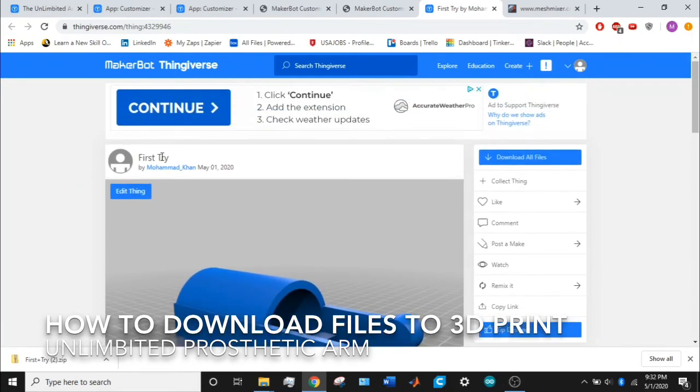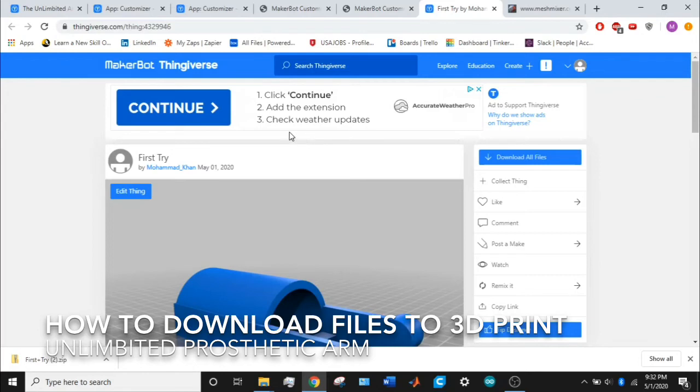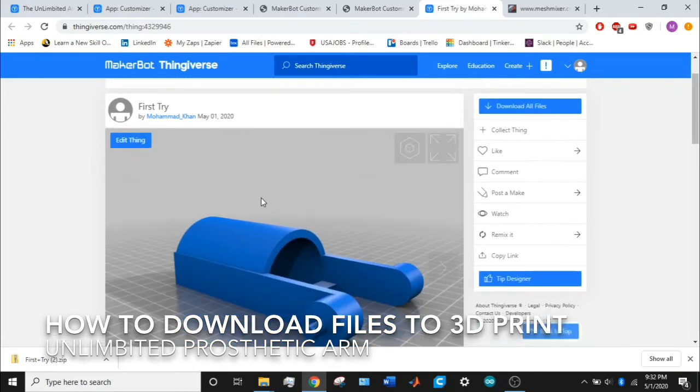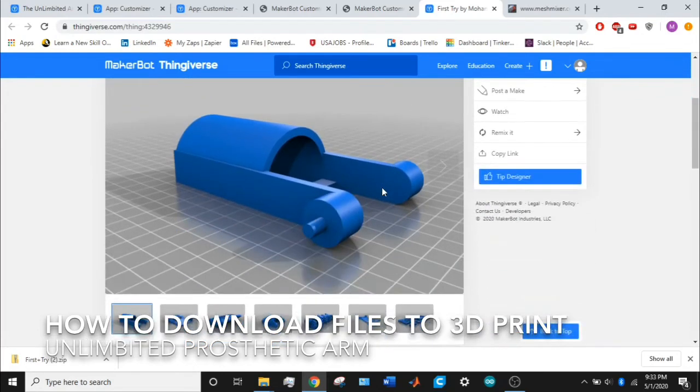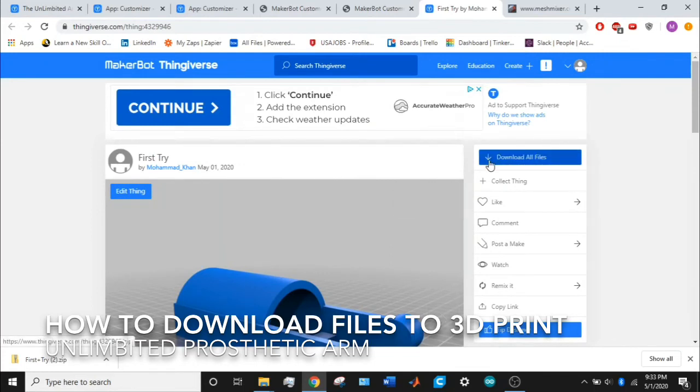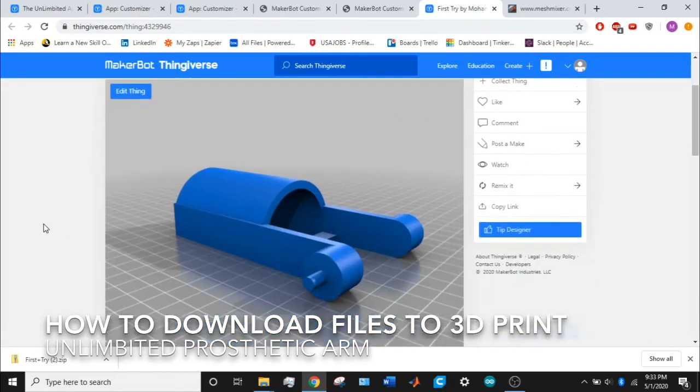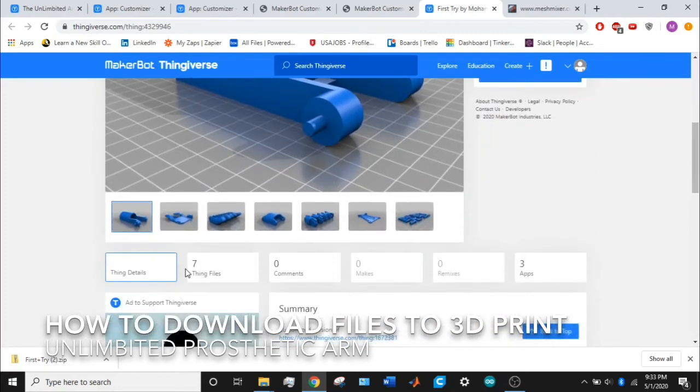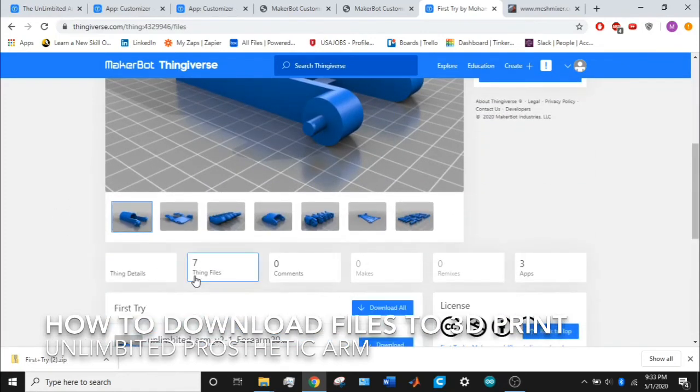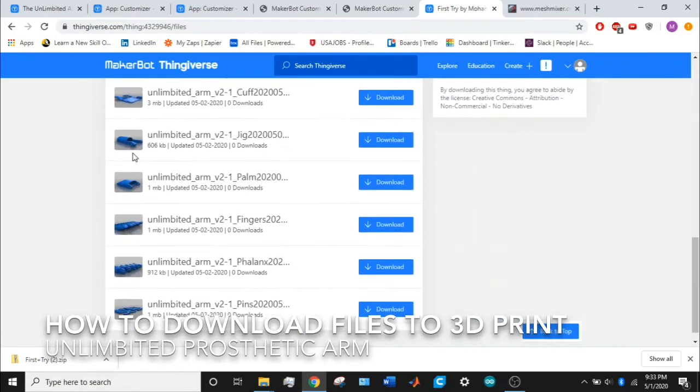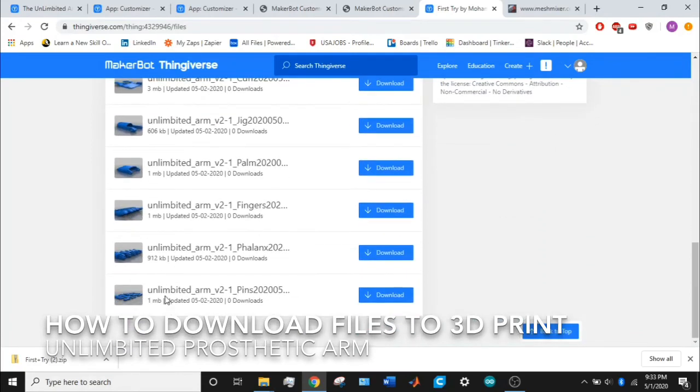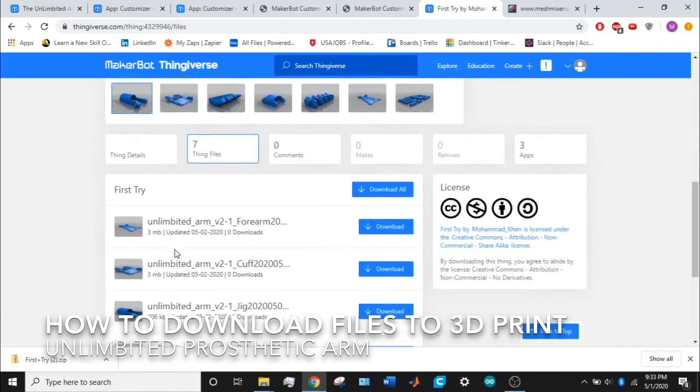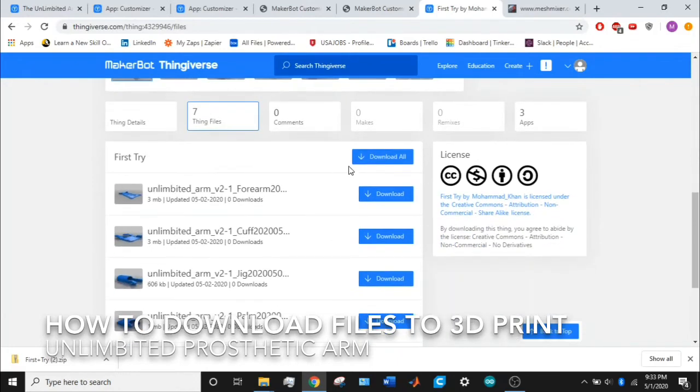It will show your username and the date you created it, available to the public if you checked the box. Now there's a button here, download all files. If you want to see what files you're downloading, scroll to the bottom again to thing files. You can see these are all the parts necessary to build this prosthetic arm. Just click on download all.